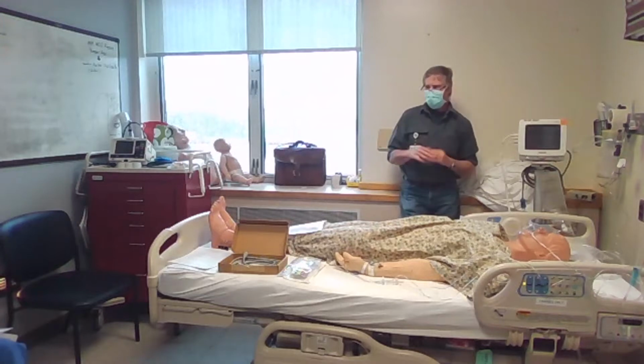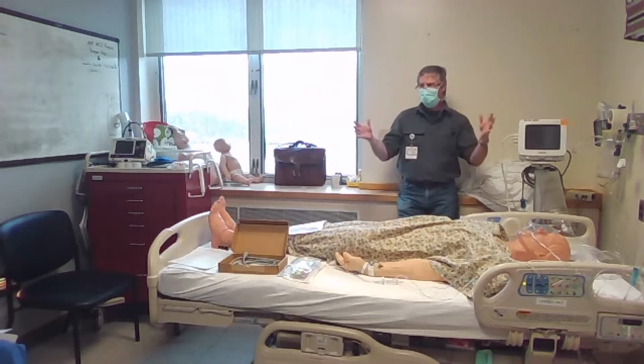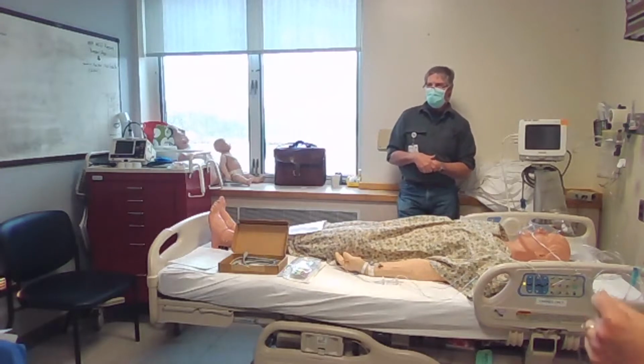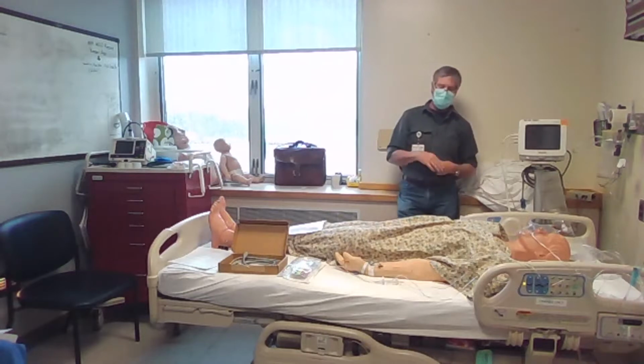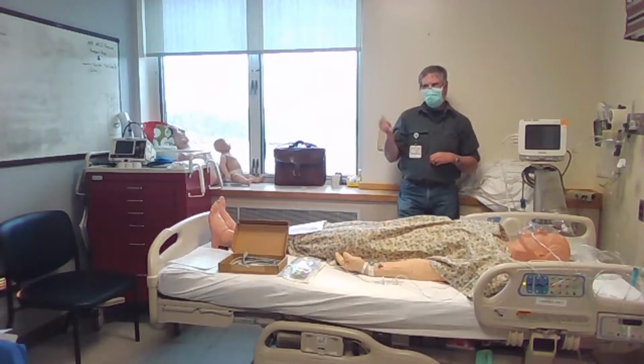You cannot increase pressure with the A-line. The A-line is just your diagnostic tool. It's just like your non-invasive blood pressure cuff, except you're getting it continuously. Real-time updates. Depending on where you zero it to, you can actually see the patient trending right there in front of you.